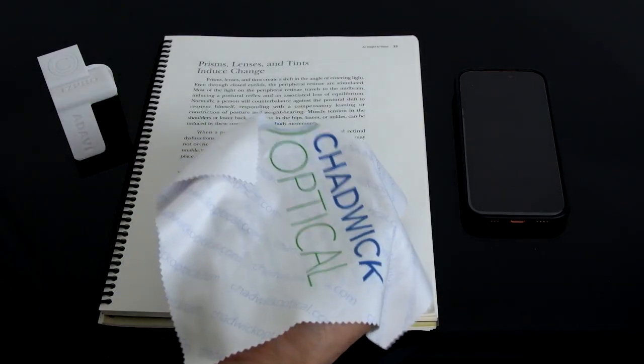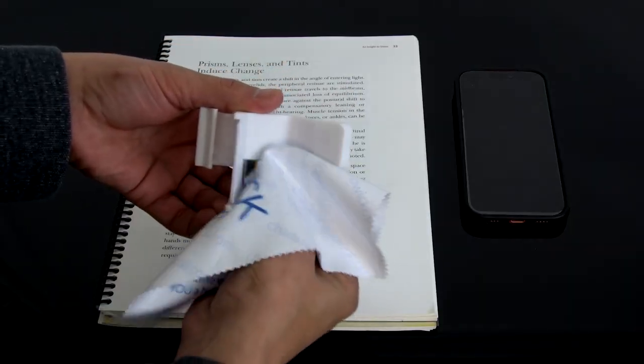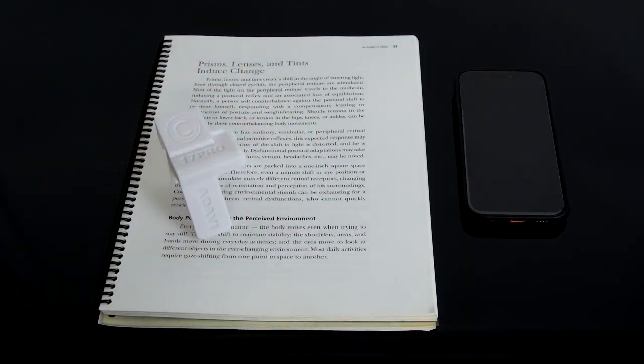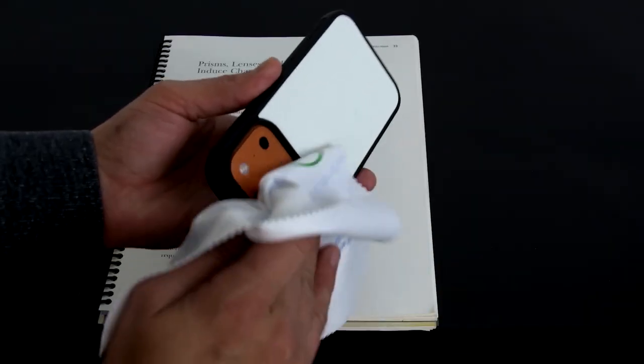Now it's time to clean our devices. First, wipe down your ADAVI Prism surfaces. Use the provided microfiber cleaning cloth. Then you'll want to take the cleaning cloth and wipe down the lenses on your phone.